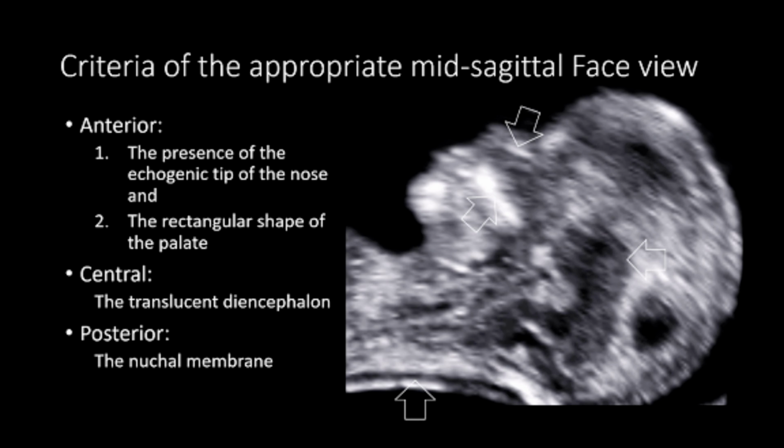If the fetus looks tiny on the screen, you're not ready to measure. The fetus should fill at least 2/3 to 3/4 of the image. You want the head and upper thorax dominating the screen so the NT lines are crisp and easy to see.